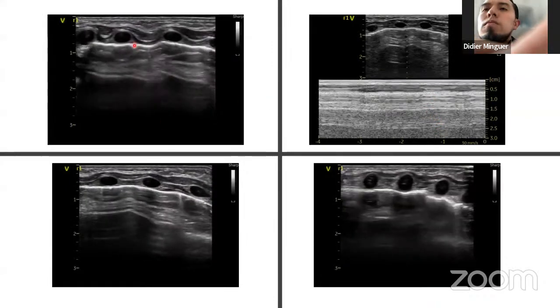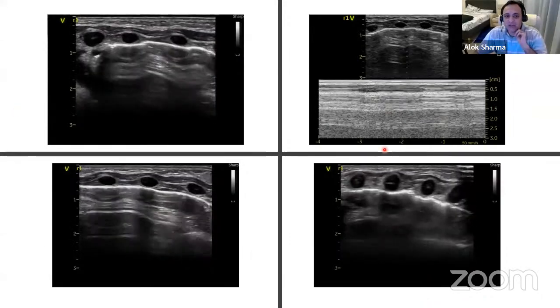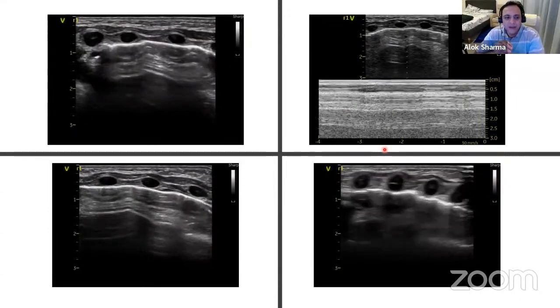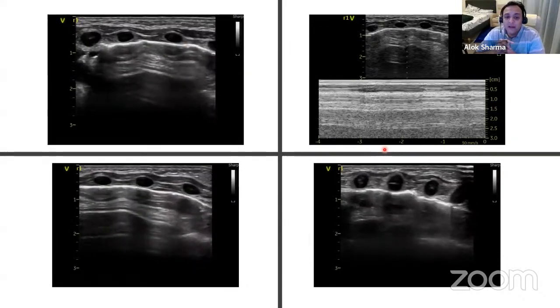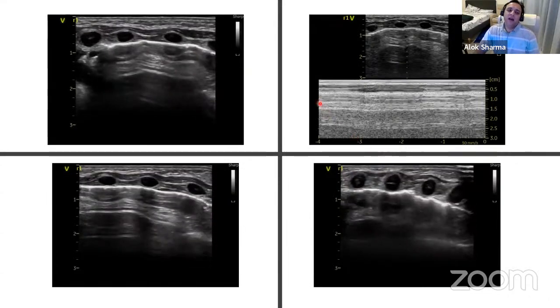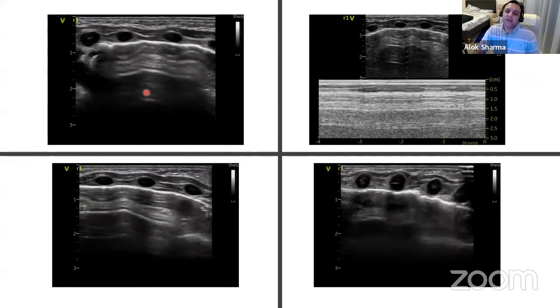There is a small anterior pneumothorax. And this is what I want to mention to you: very, very small air bubbles and air pockets can present like this and be very confusing. Really, your mental modeling is very important in those circumstances. So on X-ray, we had a very small air leak, an anterior collection.